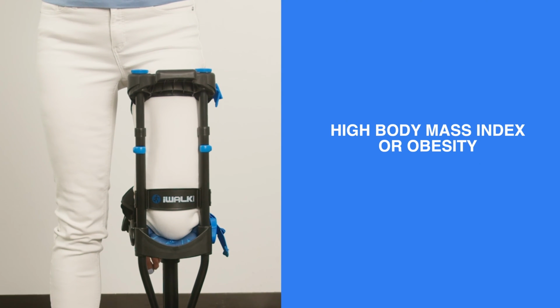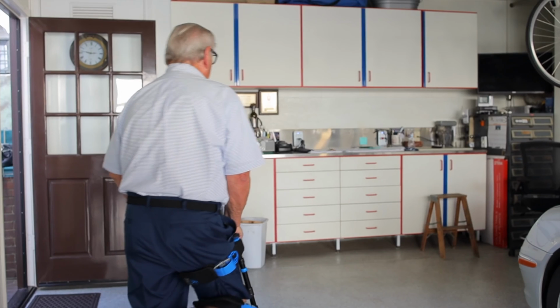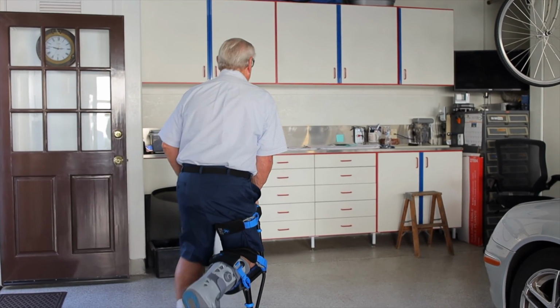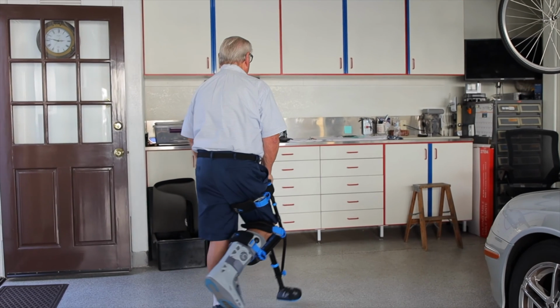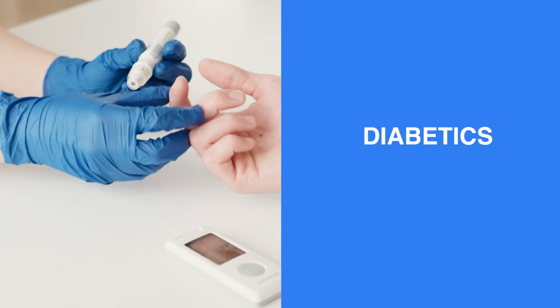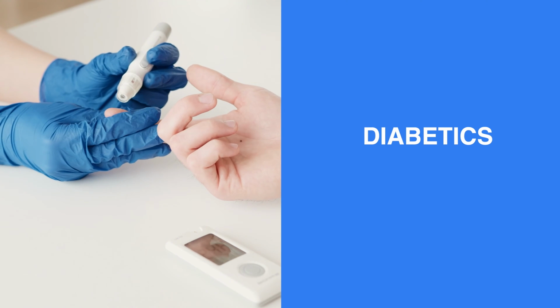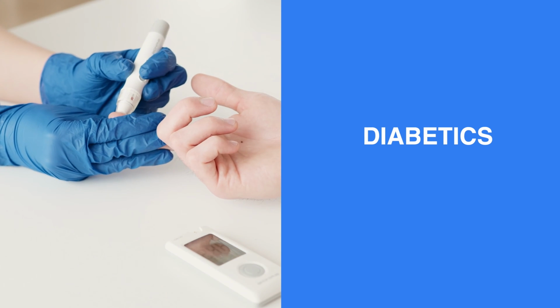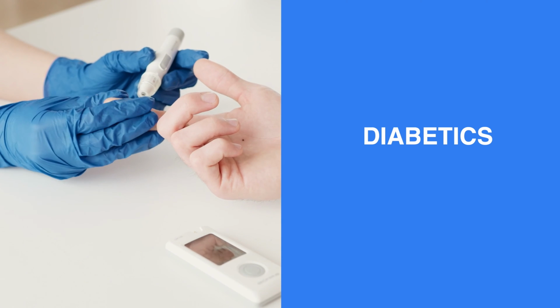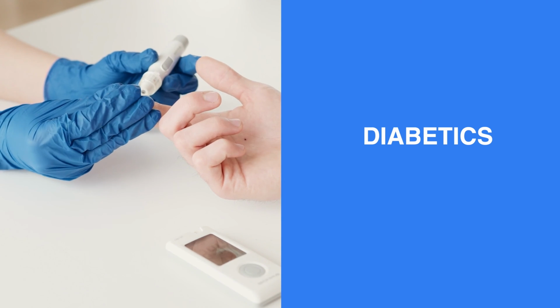High body mass index or obesity. The iWALK crutch recruits the upper thigh to help stabilize the device, so a high body mass index results in more uncontrolled movement of the device. This reduces stability and control, which makes it harder for the patient to adapt. Diabetics. Type 2 diabetes is often accompanied by obesity and lower limb neuropathy. If your patient has these conditions, they are unlikely to adapt to the iWALK crutch.